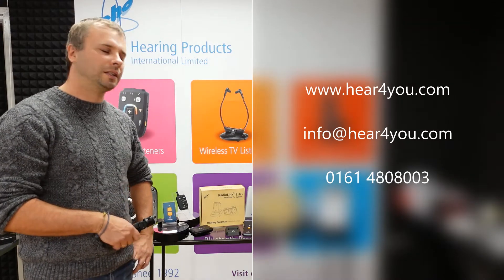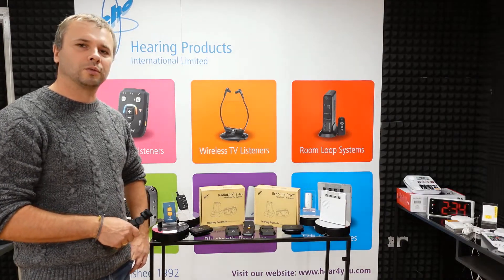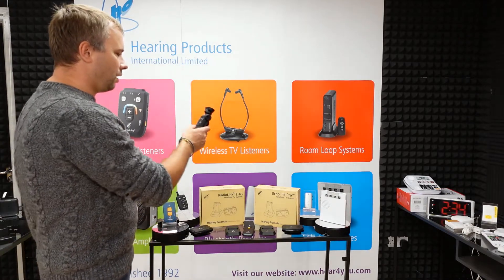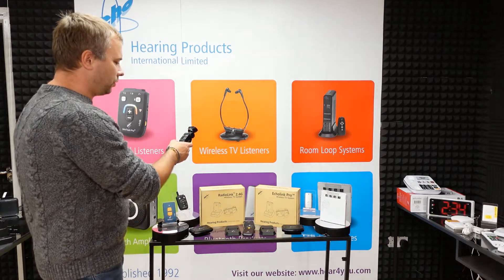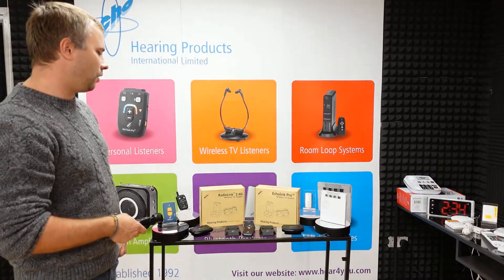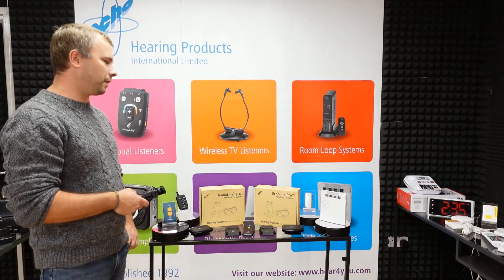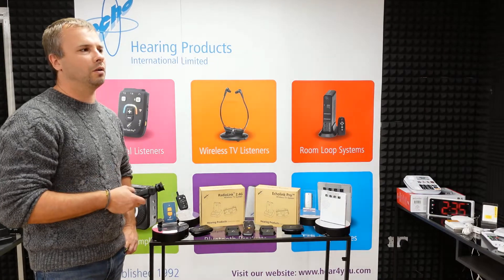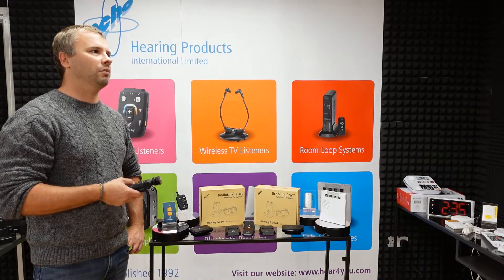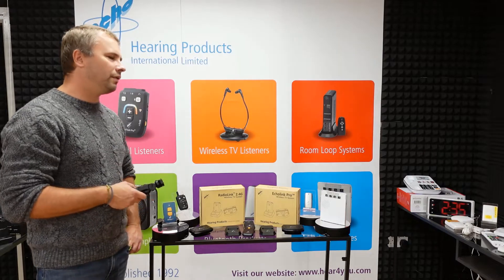Let's start — I will talk about this product a little bit and also show you a few differences between the new Echolink Pro and a model which is very similar but operates on a different frequency. Maybe we'll start with: what is the TV listener? Because some of you might not have heard that before and wonder what this product is for and who the user is.